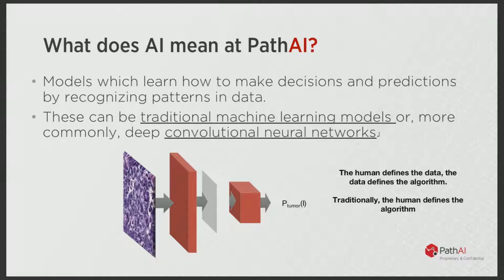One is understanding what's inside the images, and the second is using deep learning to directly infer patient-level phenotypes and outcomes from the images. We use traditional machine learning models for certain things, particularly making inference at the patient level, where n is often very small. But anything that's directly operating on the image is almost always some variant of deep convolutional neural nets, which really are the state of the art for image processing.